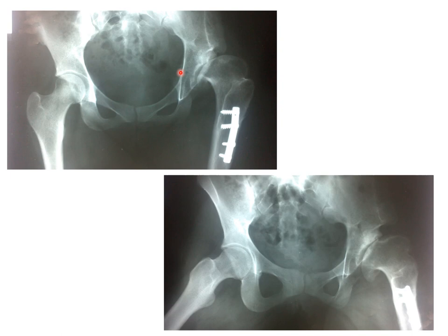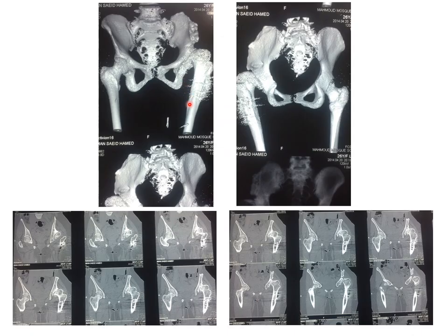You always have to do a CT scan before planning any operation. The CT scan shows the obvious subluxation of the head and the metal work inside. Looking at these cuts: this is the normal hip, this is the affected one. You can notice how shallow the acetabulum is on the different slides.